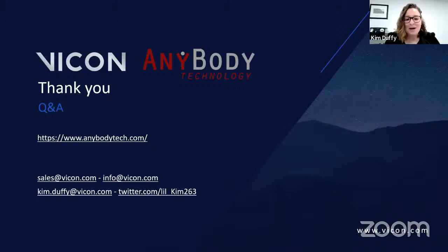Next question, well, a question and a comment. Thank you very much for the presentation. Let's consider a gait trial. Would it be possible to set a specific posture for a subject, for example, through the angles describing lordosis, which is not derived from the markers? Yeah, so you could overrule the markers and impose additional drivers to the model. That is not a problem. So you can let the markers decide on certain parts of the body movement and then impose extra motion drivers as you want. Perfect.